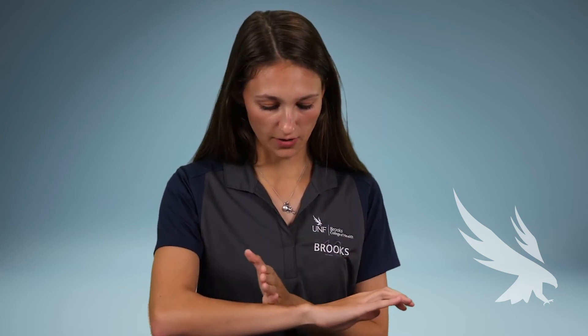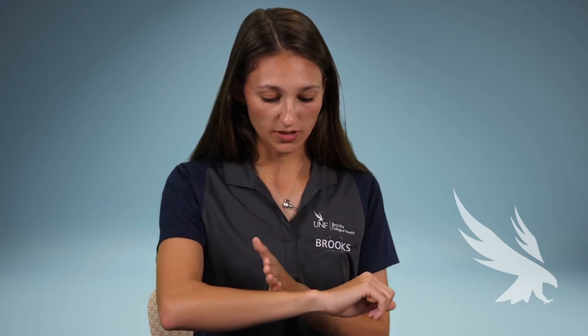One big key component when splinting is that if you have a fracture — say on the radius, one of the two bones in the forearm — you really want to immobilize the joint below and above where you fractured. So if we've broken the arm, we want to immobilize the wrist and the elbow. The other key component is capillary refill: you want to make sure there's blood flow before and after you apply the splint, because if you had blood flow before but not after, your splint is too tight and cutting off circulation — we're not making a tourniquet here, we're just immobilizing.